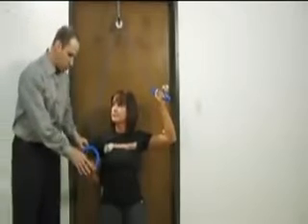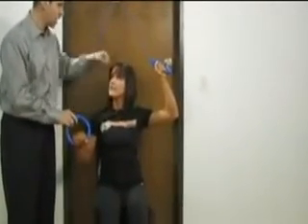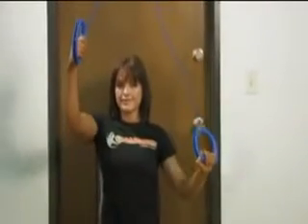And in the position she's holding it right here, which is a stirrup position, a neutral position of the hand, we're actually going to change that. So let's switch hands. Let me give that to you there, and we're going to do a thumbs up position. So this is a little bit more natural for a shoulder flexion action. Now try it that way, and come all the way up.